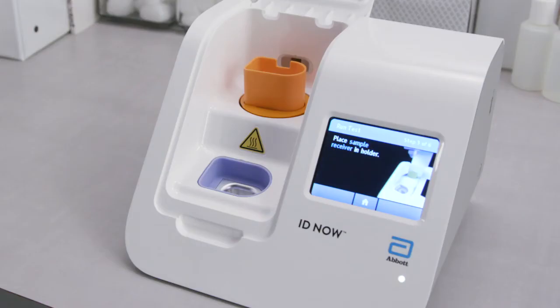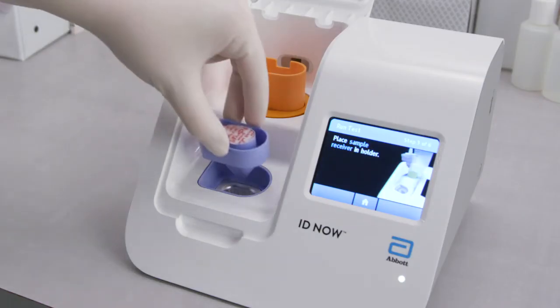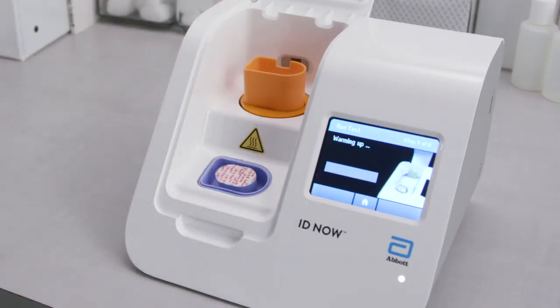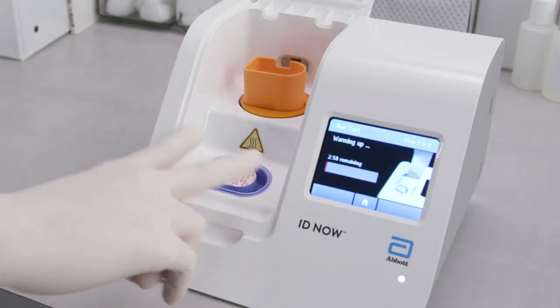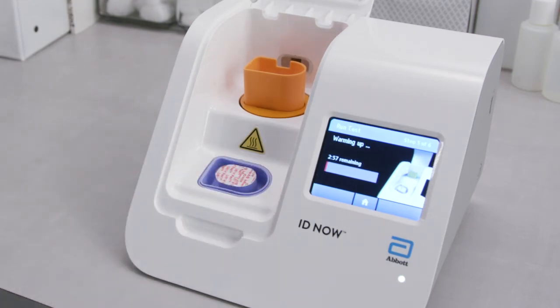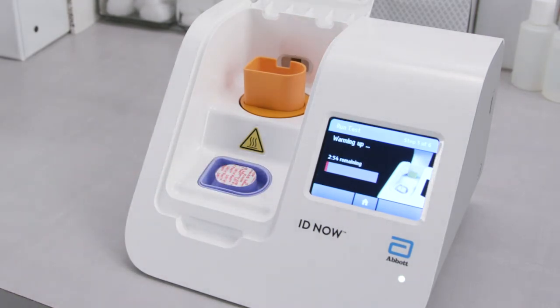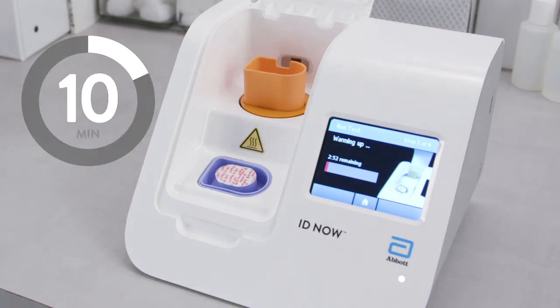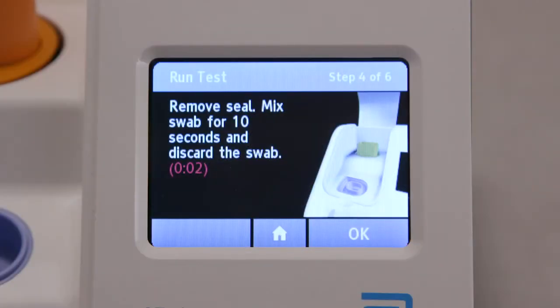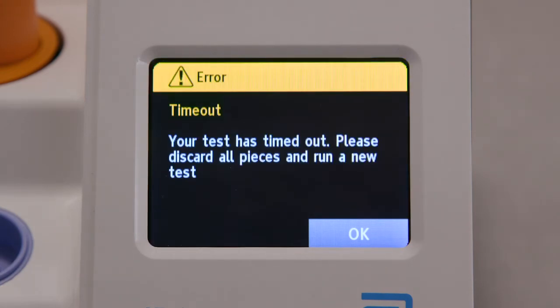When prompted, insert the blue sample receiver into the blue sample receiver holder. Make sure that the sample receiver is completely inserted. Please note that once the sample receiver has been placed in the holder, you will have 10 minutes to start the test. If the test is not started within 10 minutes, the instrument will time out and all test pieces must be discarded.